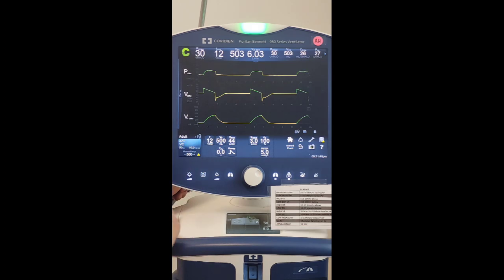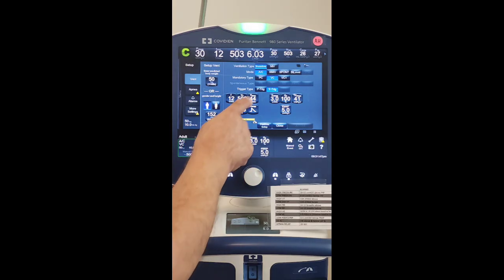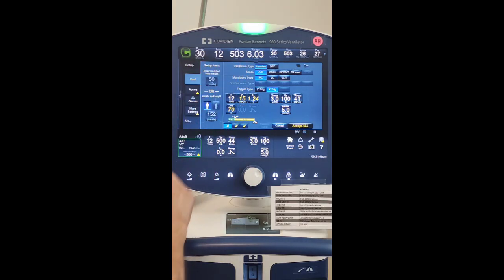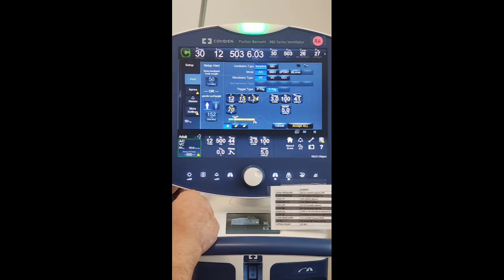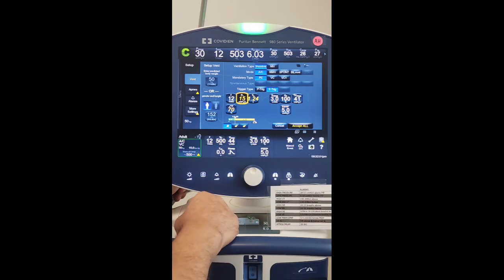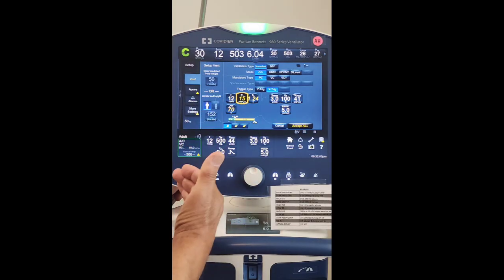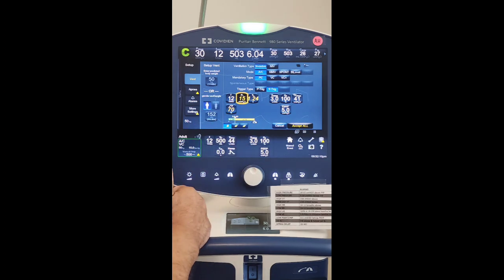So we're going to go in there and switch this over to 15. We might have to adjust a few other things in here. So I'm going to go to pressure control up here. This one already has 15. Normally I would go in here and adjust it to 10 to 15 centimeters of water pressure. Remember, when you're in pressure control, now you have an I time. We don't have flow rate anymore, peak flow. We have I time.